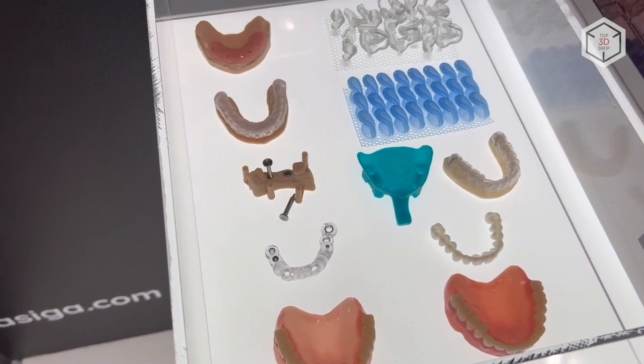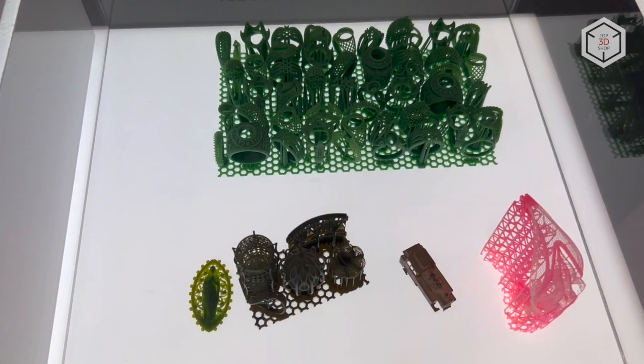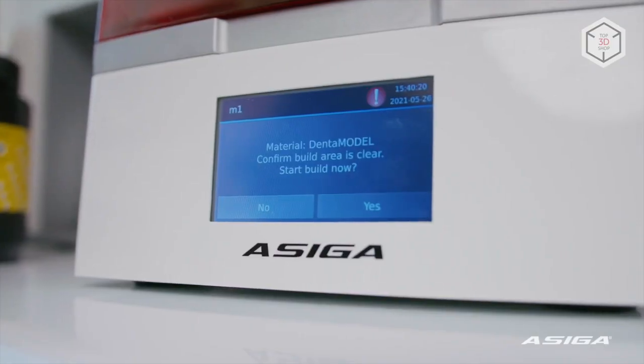For the basic model, the minimum pixel size is 62 microns. Max X machines are ready to print with a pixel size of 27 to 43 microns. At the same time, the standard model has the largest build volume of 119 x 67 x 75 millimeters.